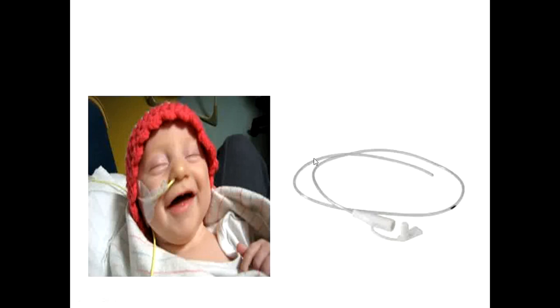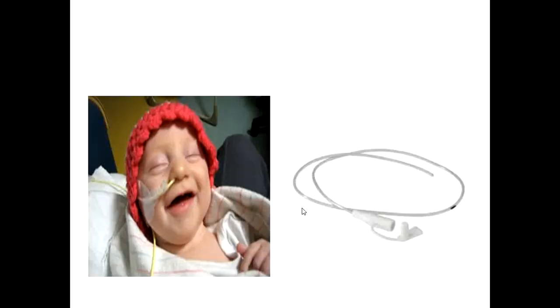So what is this nasogastric tube shown? And the baby is very happy. Only few babies would be very happy, but most of them will be annoyed on the nasogastric tube. So give 3 indications of this procedure: for gastric lavage, secondly for nasogastric feeding, and third you can say for gastric decompression.